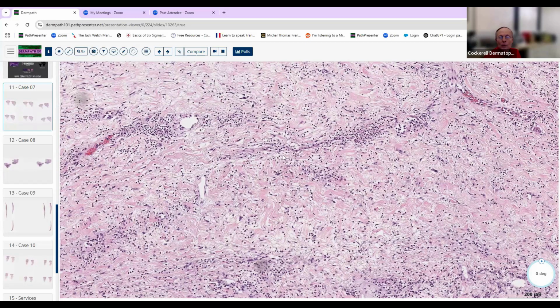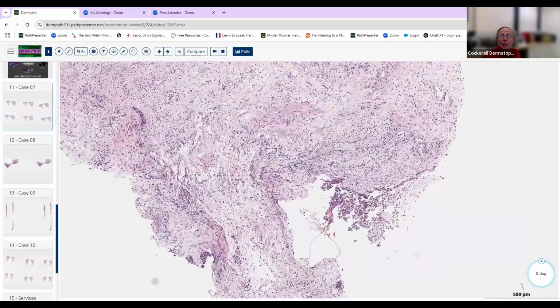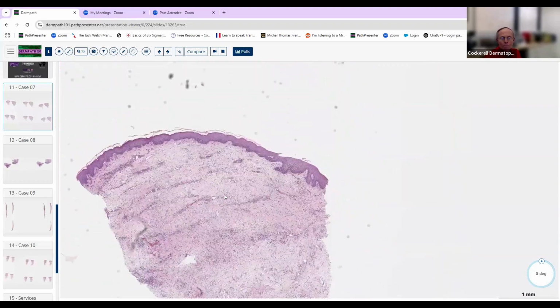And then you couple that with the fact that you've got a collection of almost suppuration at the bottom. Maybe this was a localized abscess that had cellulitis off to the side of it, and they biopsied into the lesion. Maybe the abscess was a solid area and they thought there might be a neoplasm there or something. I'm not sure why they did a punch. But if you just see the stuff at the top, this really looks great for cellulitis.